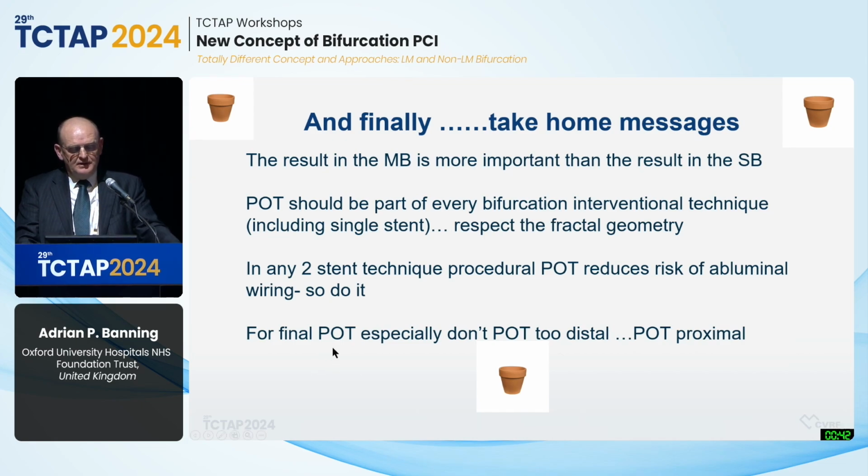And the final message, if you're doing final POT, don't POT too distal, POT proximal.